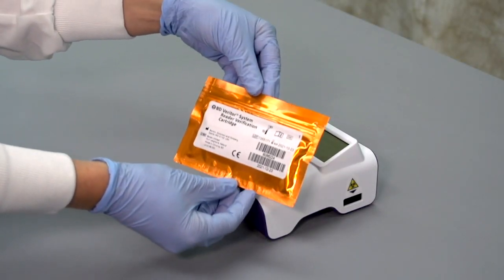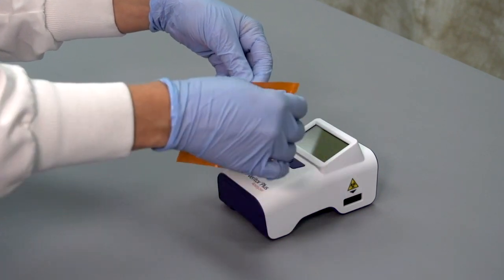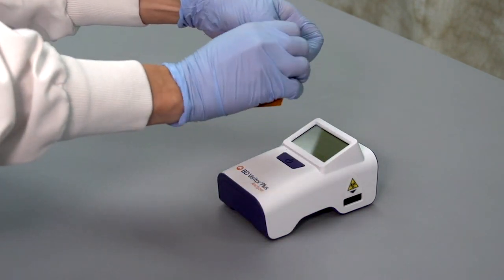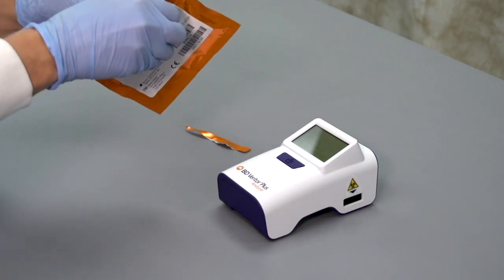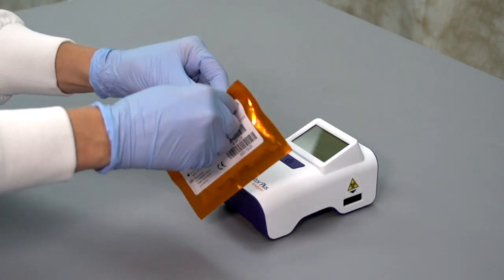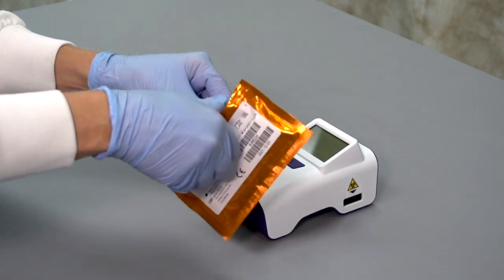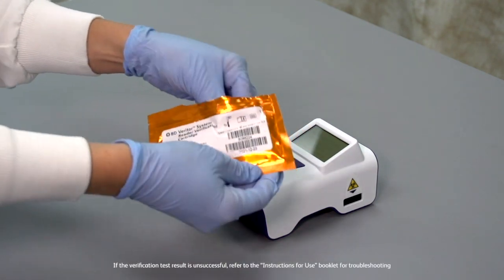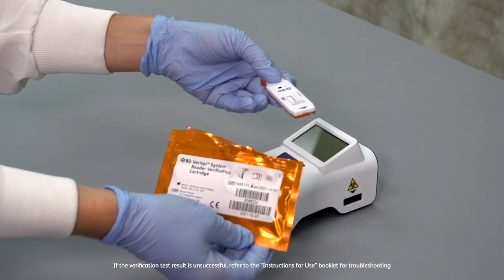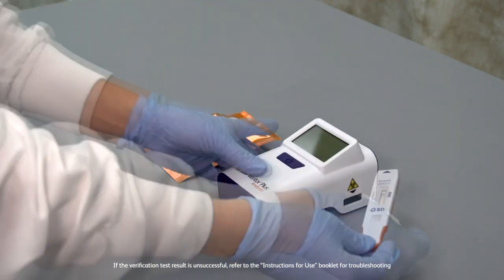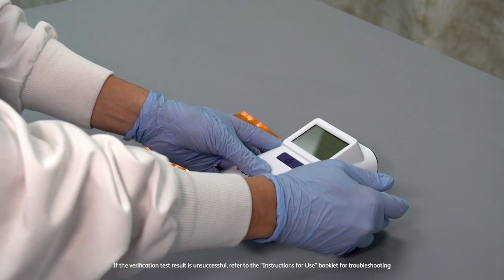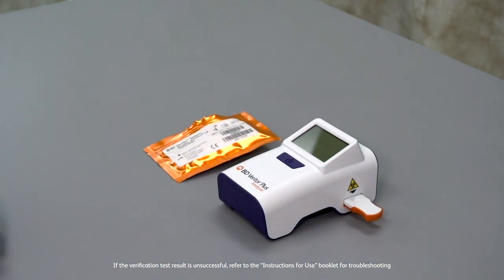For the first time use of a BD Veritor Plus Analyzer and before testing patient specimens, a system verification check should be performed with a supplied and reusable verification cartridge. Using the Analyze Now test mode, simply insert the orange verification cartridge into the test device slot. A distinct click indicates when the test device is fully inserted.